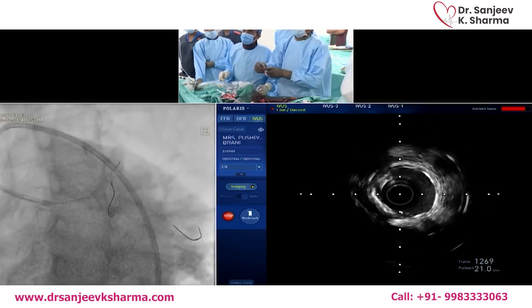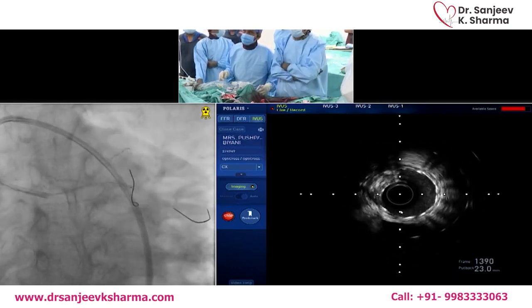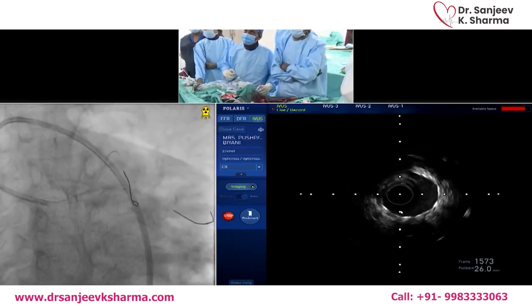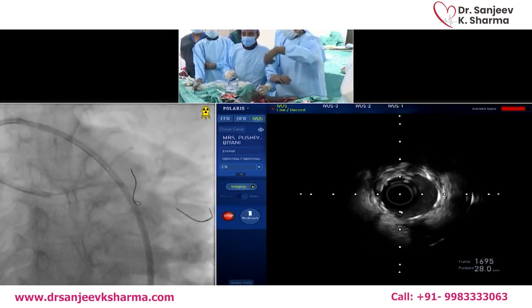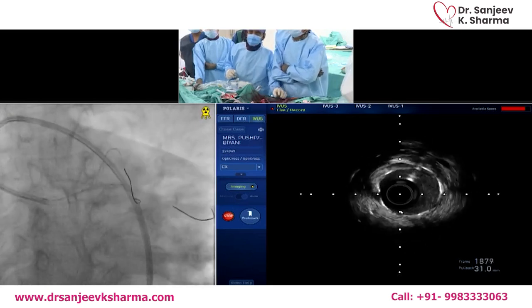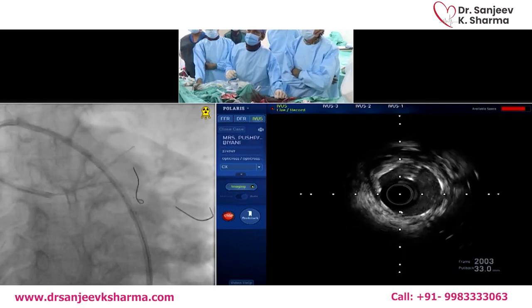Now we are coming to the proximal circ. Most important is to see what's going on at that bifurcation site, that it's well apposed there, which looks really good. Fluoro, where are we? Oh, fluoro is still in the OM. We are 1 hour late, so you can move. Just IVUS pullback, just circumflex, and then we are done. We are not going to show anything. This is a really important teaching point.